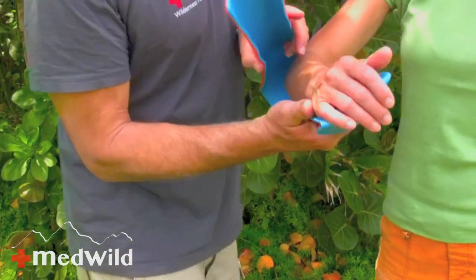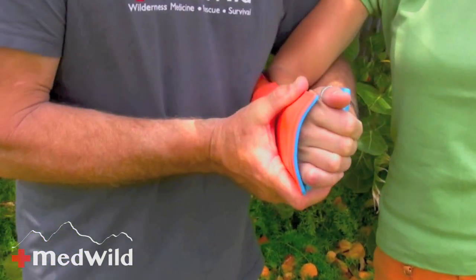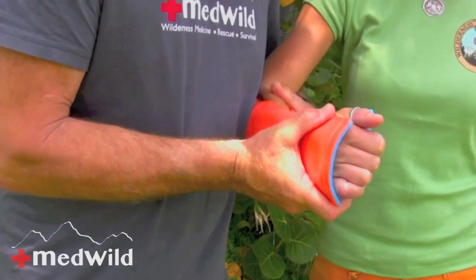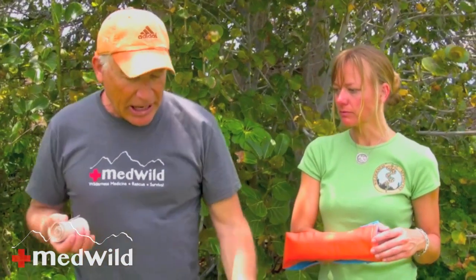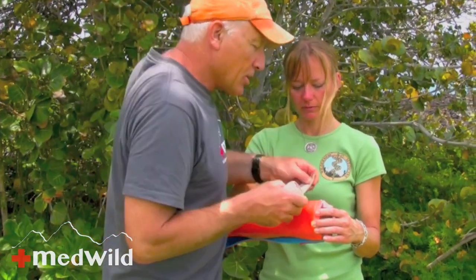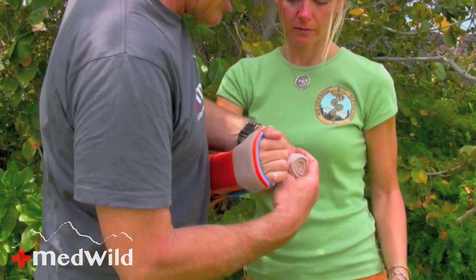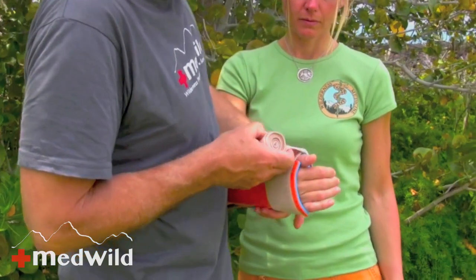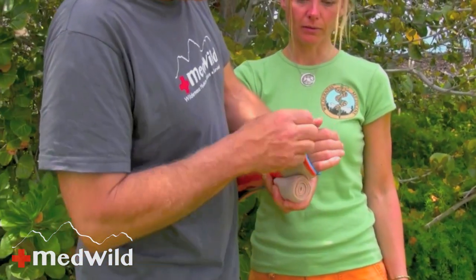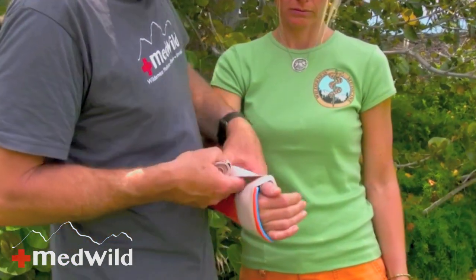Now we'll fit this back on Denise — looks pretty good already. I'm going to finish a few curves, then put an elastic wrap around it. There's really no special technique for this portion of the wrap; I just try to make it as neat as I can. You don't want it too loose and you don't want it too tight. I usually put a couple of extra wraps at the beginning, and I make sure there's no pain or pressure points — in this case checking her thumb.